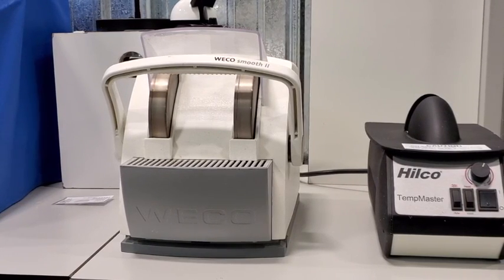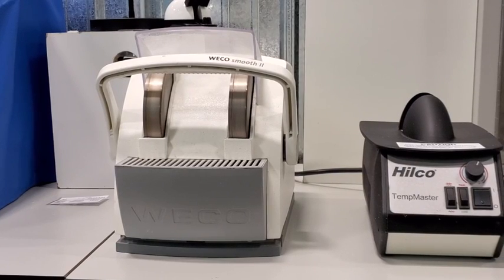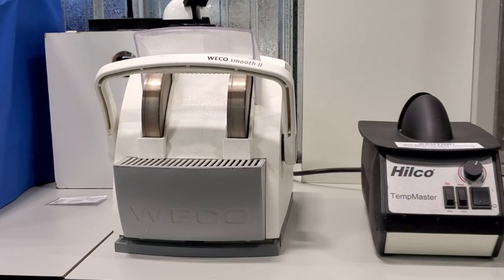Today we're going to be talking about maintenance for your hand stone. There are a lot of different hand stones out there. Yours might look a little bit different than this one, but as far as the maintenance goes, it's all pretty generic. As far as daily maintenance goes, you're going to want to check your sponge.